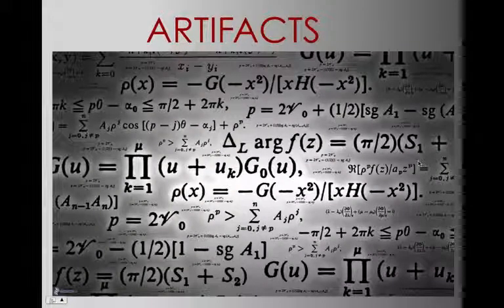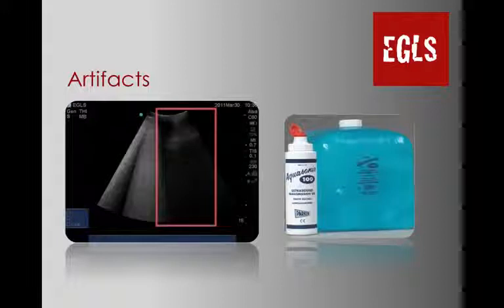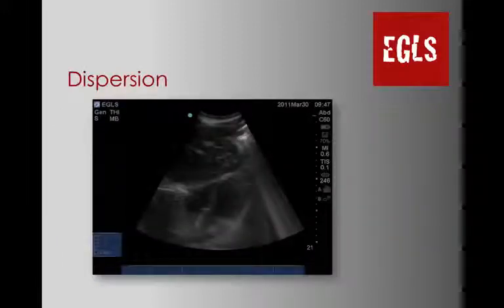While the focus of the course is not on artifacts, let's go over some of them so we make sure we interpret the images appropriately. If we don't have enough gel, we'll lose part of the screen in which it will be impossible to see any organized image, since the ultrasound beam has been dispersed by air between the transducer and the patient's skin. Whenever we have a hard time obtaining images, make sure you have enough gel under your probe.